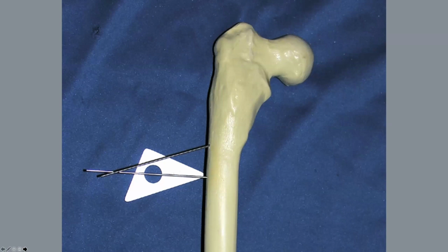Now, I do sometimes use a sterile goniometer intraoperatively, which I think is extremely valuable and very helpful, especially for the guide pin that guides the blade plate seating chisel. But if you look in the sets, these blade plate sets, there is every iteration of an angle in that set. So it starts at 20 degrees, and I think it goes all the way up to 110 degrees at 10-degree increments. There's an angle in there for everything. If there isn't, you can always bisect it. So what you're seeing here is using this angle here and bisecting it through the middle of that circle, and that will give you half of whatever that angle is that's sitting against the cortex of the femur.